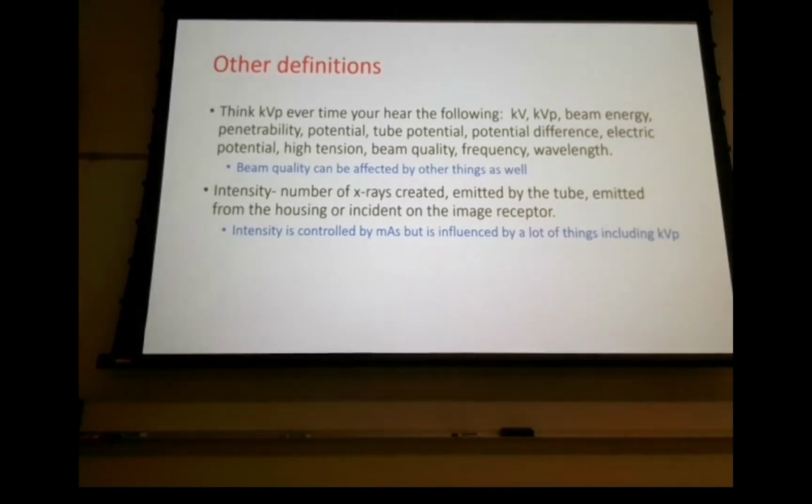And then I said, set 30 kVp on your machine and see what you can penetrate. Well, the P, again, is peak energy, right? So on the beam spectrum, we'll take a look at that here in a minute, very few of the X-ray photons that we get out of the X-ray tube when we set a kVp are going to be the peak energy, right?